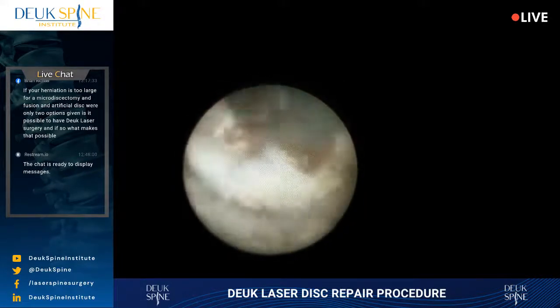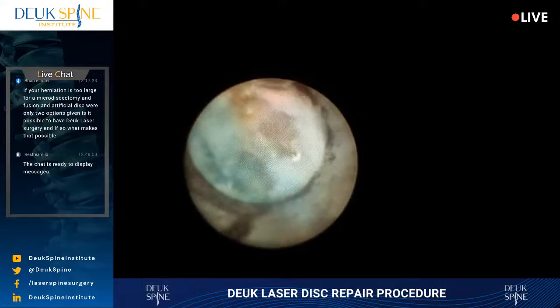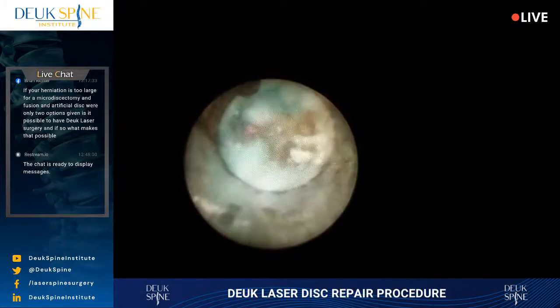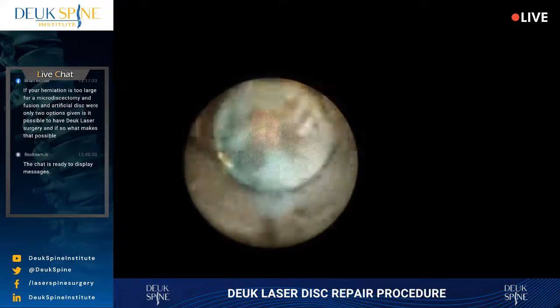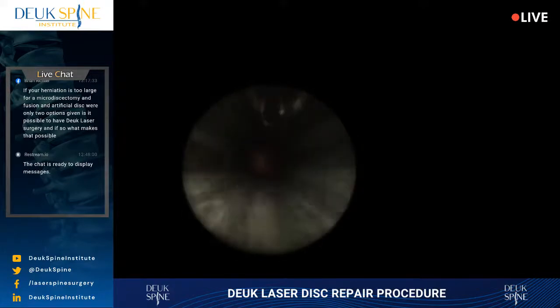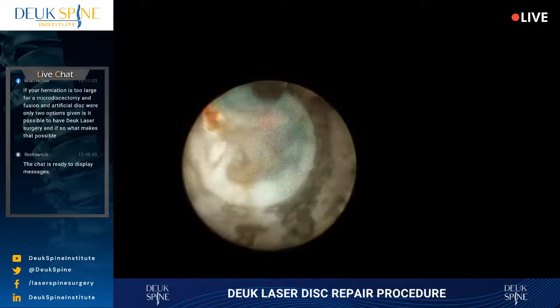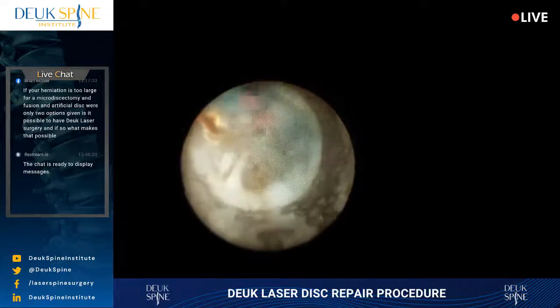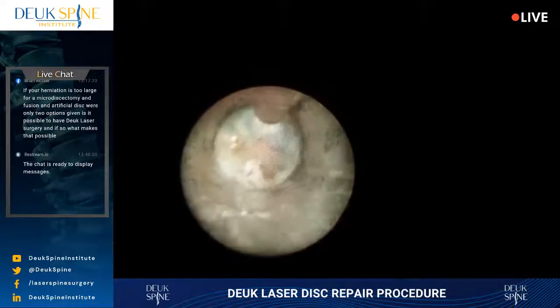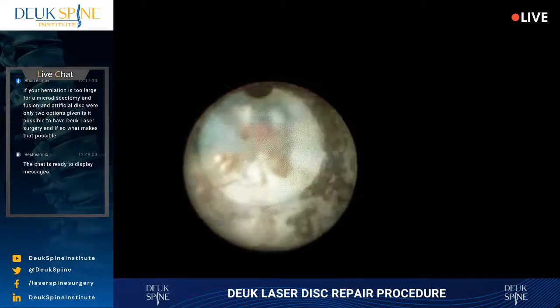right, it'll be more evident in a minute. It's literally running up and down. Maybe you guys can see that. And my tube is kind of stuck. It doesn't want to move because there's so much scar tissue back here from the inflammation. Okay? So I'm going to have to spend a little bit of time just kind of going back and forth and releasing the scar tissue, the herniation, and just getting some movement back into this disc. Because if I can't get any movement back into the disc, it's going to be hard to fix the whole problem. It's going to be hard for me to gain access to all the areas I need to.